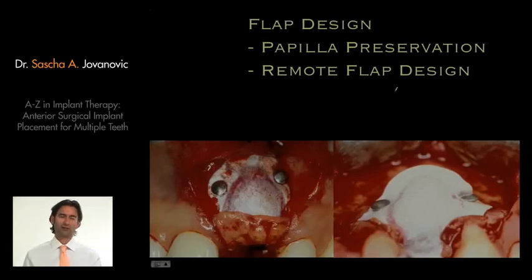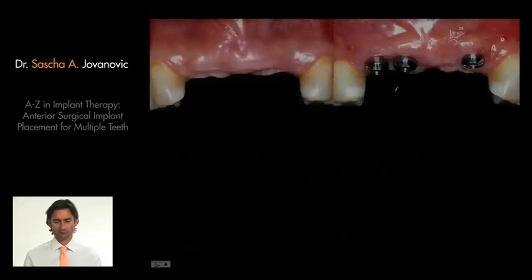And most often I'll use the remote flap design because it gives me more flexibility for treatment, it gives me more potential to place a bone graft, and it allows me more surgical control to close the flap. So the remote flap design is my major treatment option which I do here.